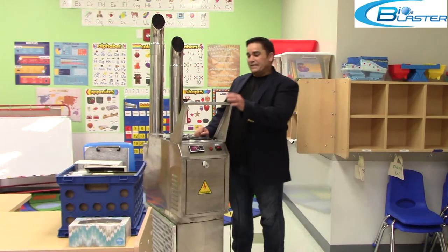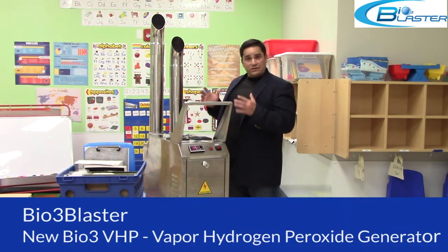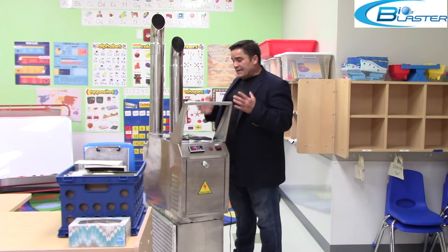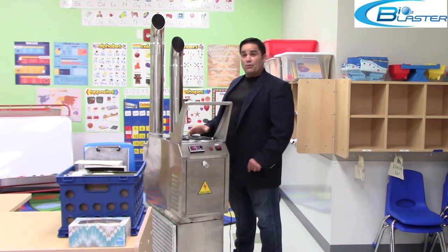Hey folks, it's Charles again with another one of our new Bio 3 VHPs. This is the vertical embodiment — it's ideal for moving in and out of janitorial closets for on-site facilities management, and this machine packs a powerful sanitizing wallop.